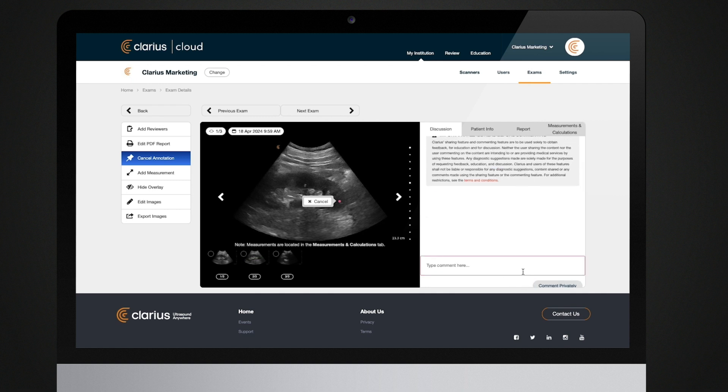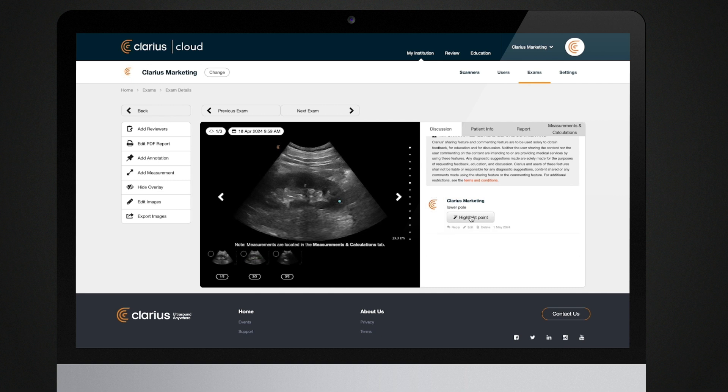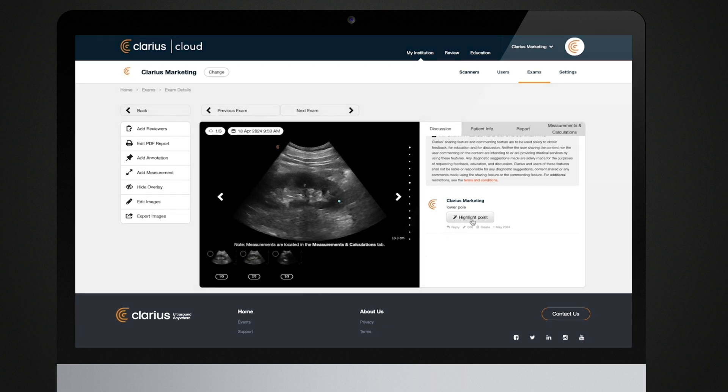If you use other medical systems, you may need to import your Clarius ultrasound data into those systems.